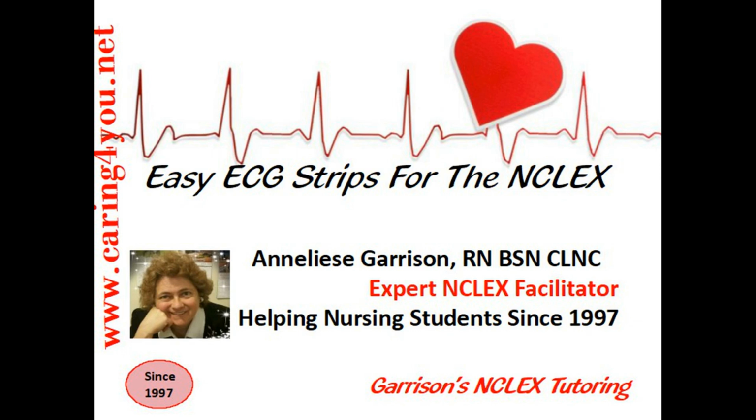This is a re-upload of a very good ECG strip presentation that I did several years ago. I'm re-uploading it because the NCLEX has changed. The next generation NCLEX has changed the way it asks questions about the ECG strips, but the reading of the ECG strips is still the same.